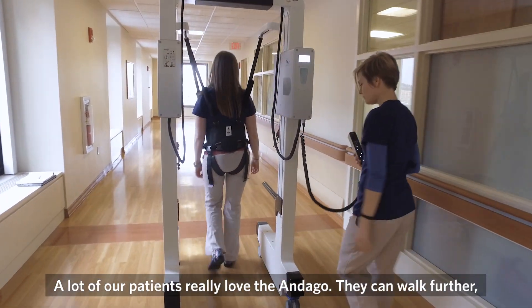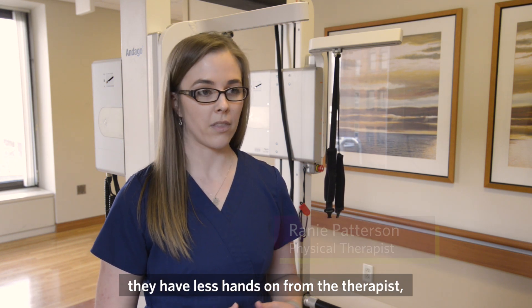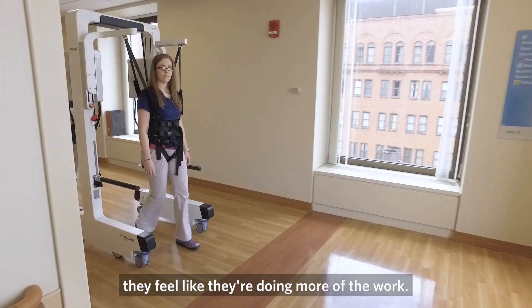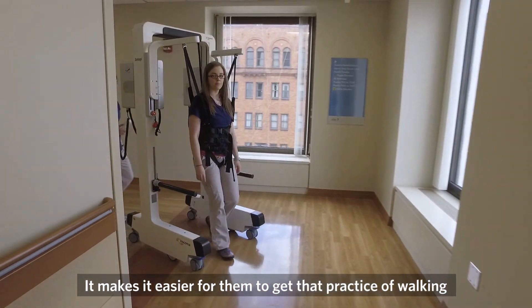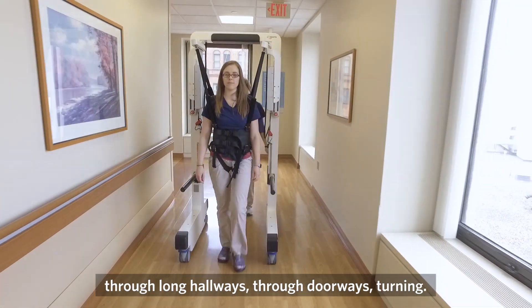A lot of our patients really love the Andago. They can walk further, they have less hands-on from the therapist, they feel like they're doing more of the work. It makes it easier for them to get that practice of walking through long hallways, through doorways, and turning.